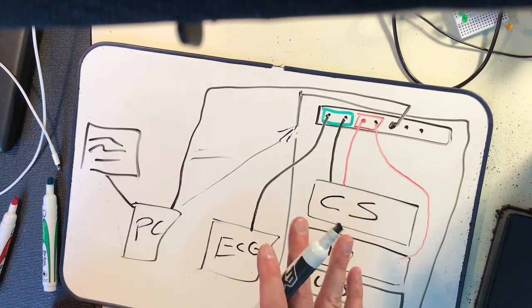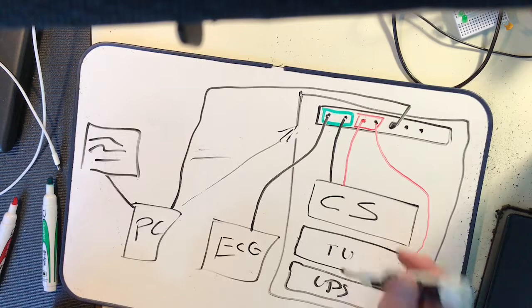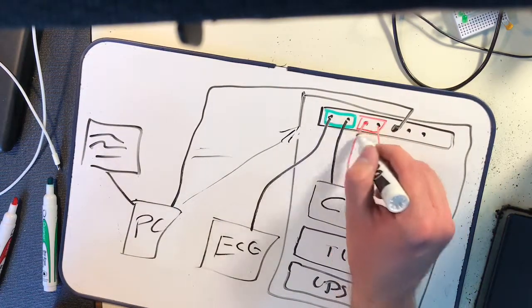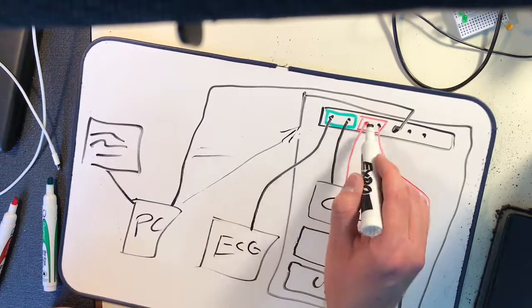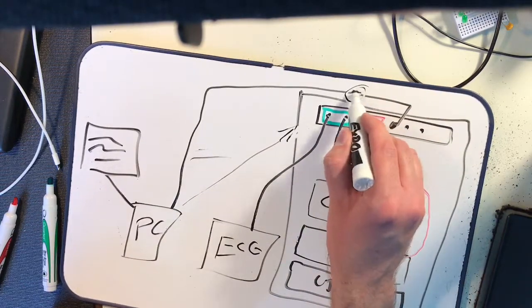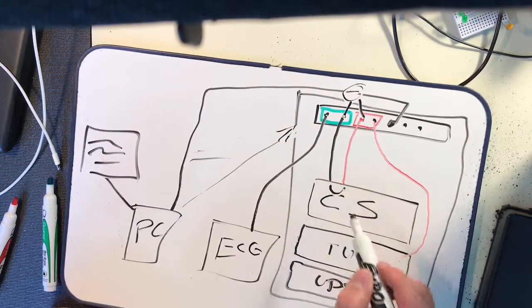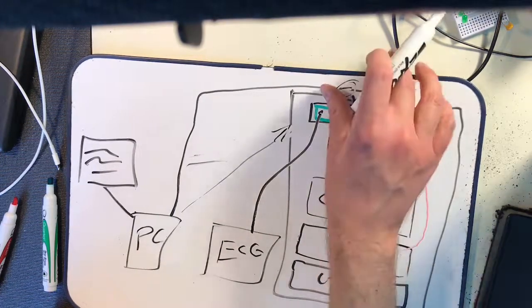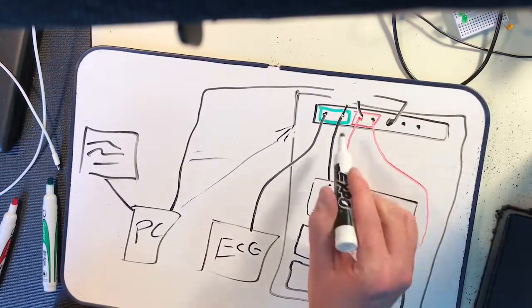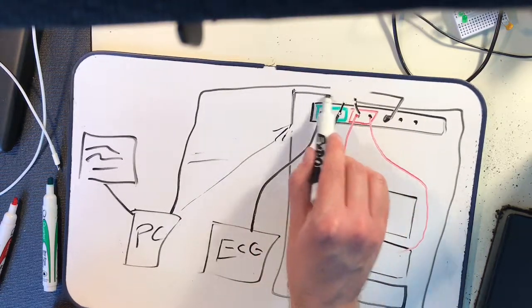But I hope this gives an example or an idea of what VLANs are, why they are used, and how they're used in BMET. You can see here that we have the two virtual switches on two different networks. So if these wanted to talk to each other, we need to have something up here like a router to connect these two together. Or the central station would need to bridge the connections or route the connections because the switch isn't able to do that. But we don't currently have that set up. So right now, these are just two isolated networks that aren't talking to each other.